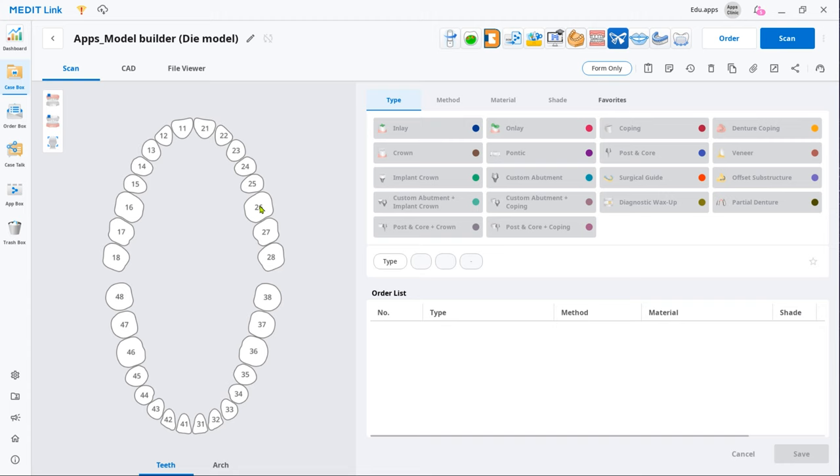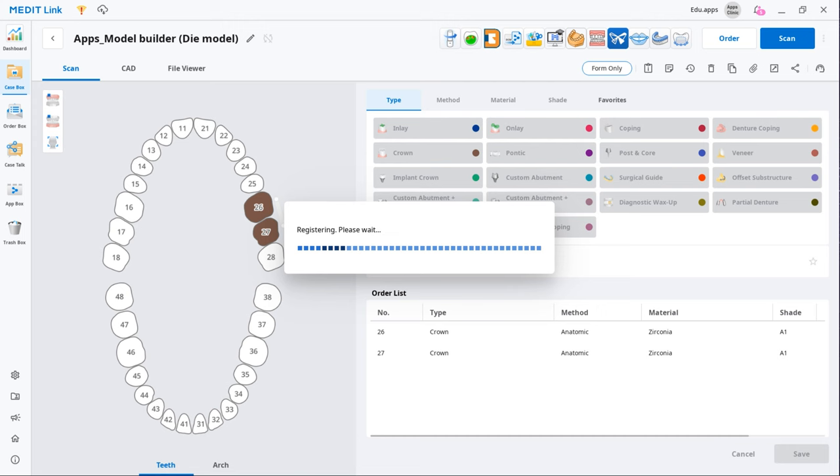You will need the scan data to work in the app. Create a new case, select Designated Restoration as Product Type, and then scan both arches.